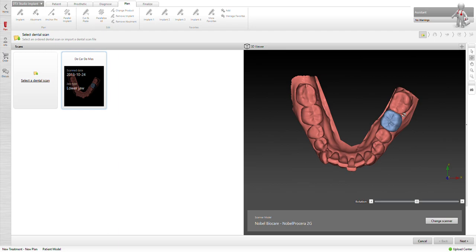There we go, we have it. We can go ahead and open it. Smart Fusion now has it in here and so I can change the scanner if I want. This happens to be a Nobel Procera desktop scan, but you can choose the different scanners you want.